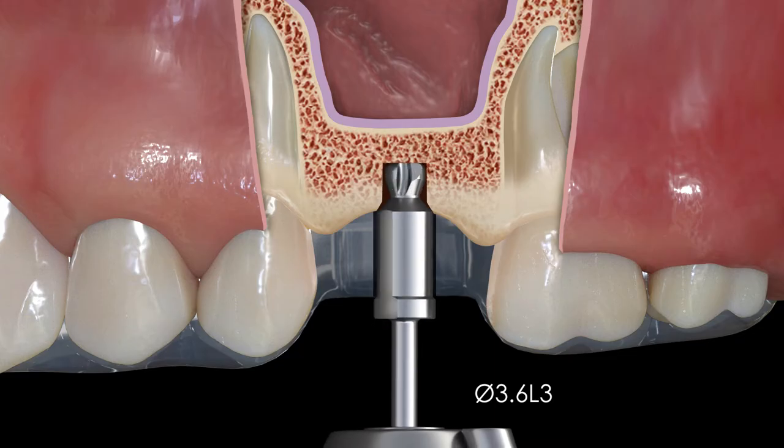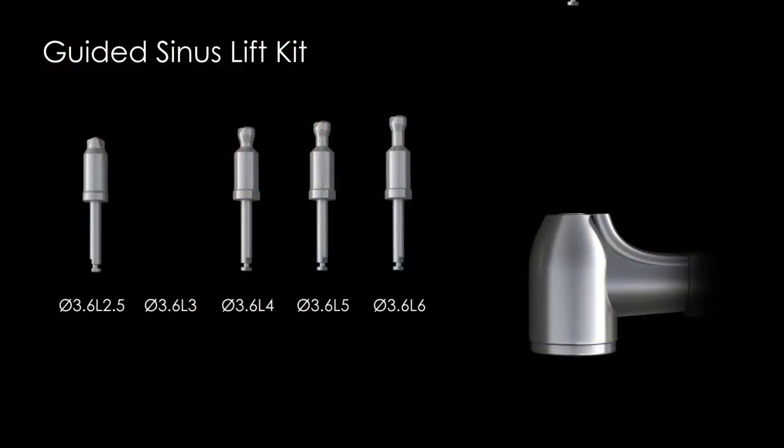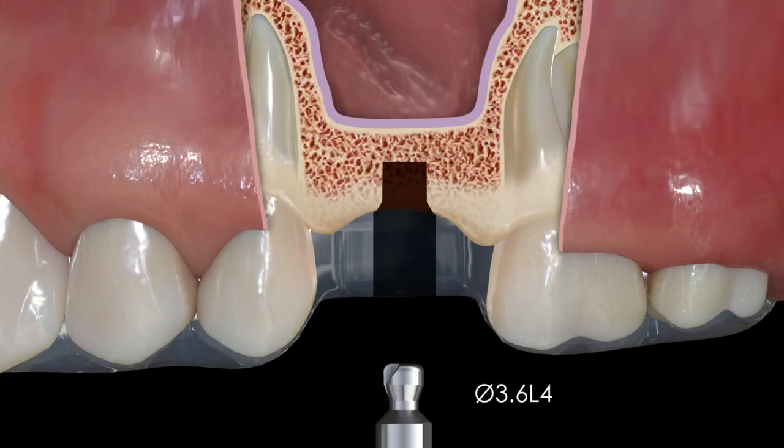It is recommended not to skip any drills in the sequence. As with all the drills in the kit, you should drill in a clockwise direction until the drill stop bottoms out on the surgical guide. Proceed to the 4 millimeter long drill and take it to full depth also.